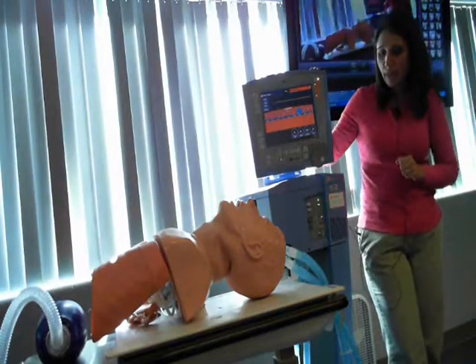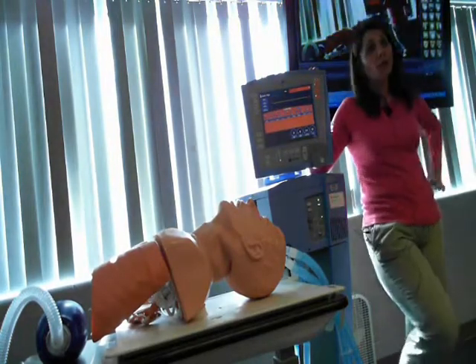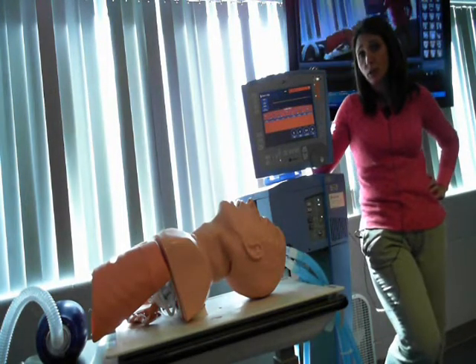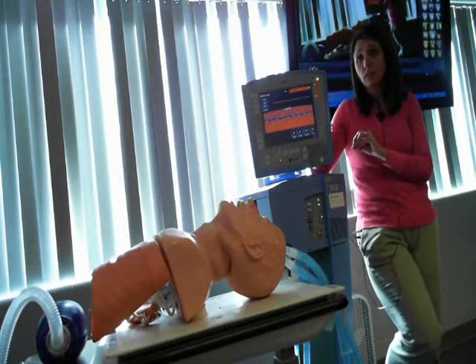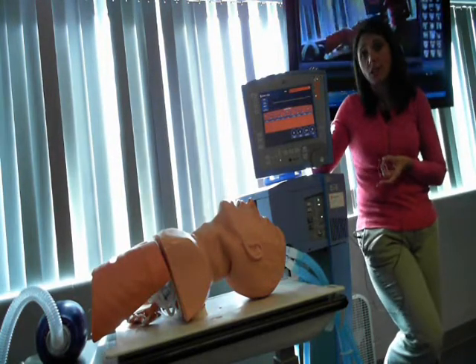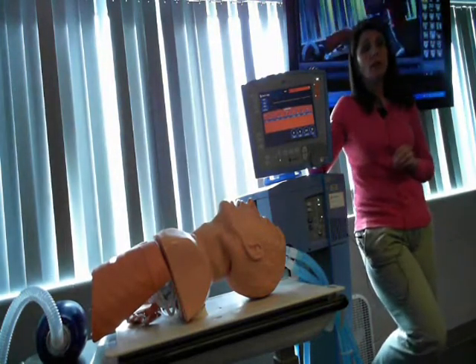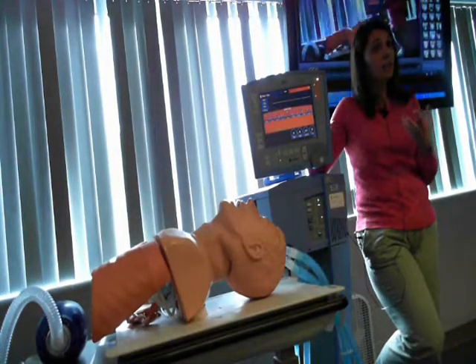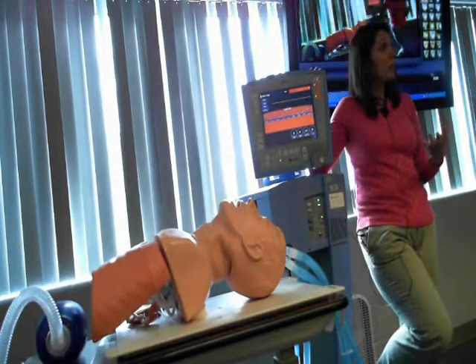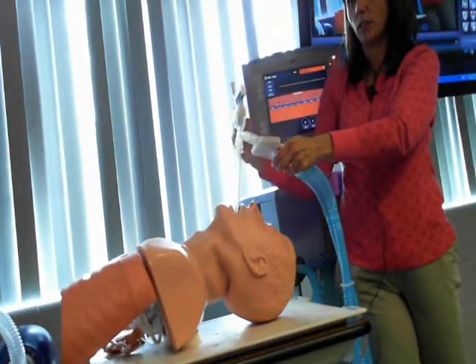His airway is not going to behave for me and be blocked. So, the big thing you need to know, if you have a high peak pressure alarm, the most common reason for a high peak pressure alarm is that your patient is coughing. High peak pressure alarms, your first intervention needs to be to drop a suction catheter. Okay? Oftentimes, if they are coughing, they've got mucus built up that needs to be removed, or their airway is obstructed. I instruct people to drop their suction catheter, which is what I have done to block his airway. His suction catheter is completely in his endotracheal tube.